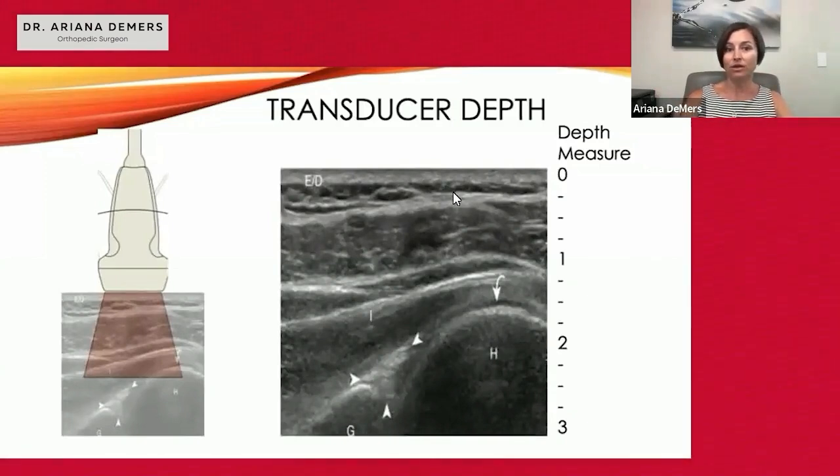With skin at the top of the image, and then the loose areolar tissue, deltoid, tendon, and muscle of the rotator cuff tendon, humerus, glenoid, and labrum.